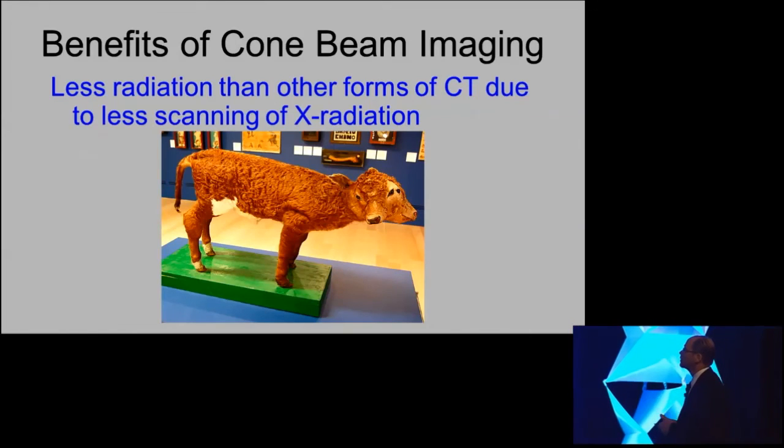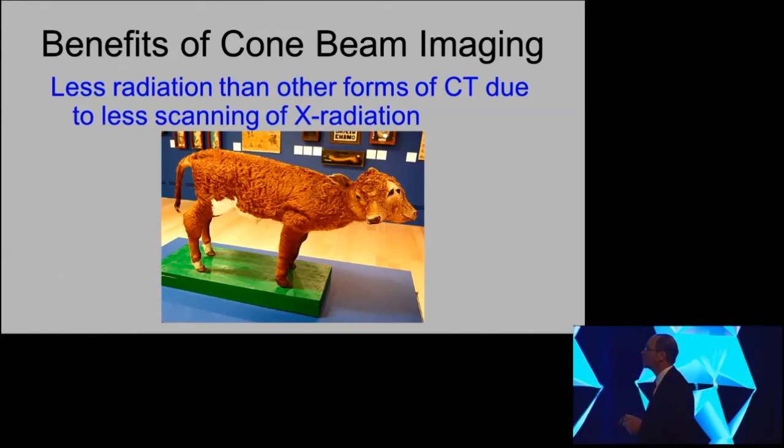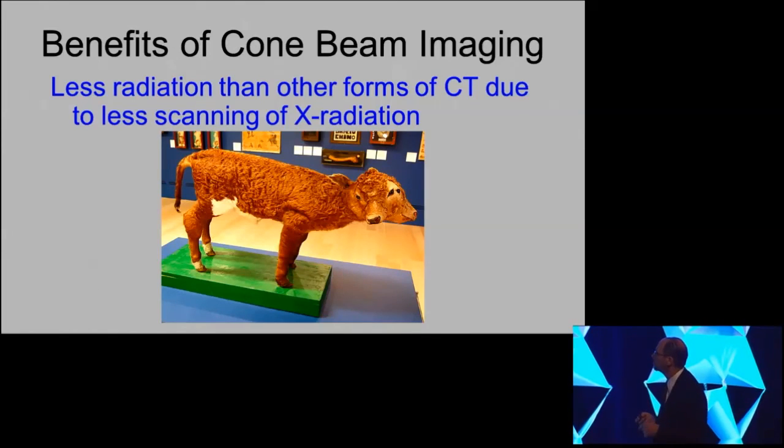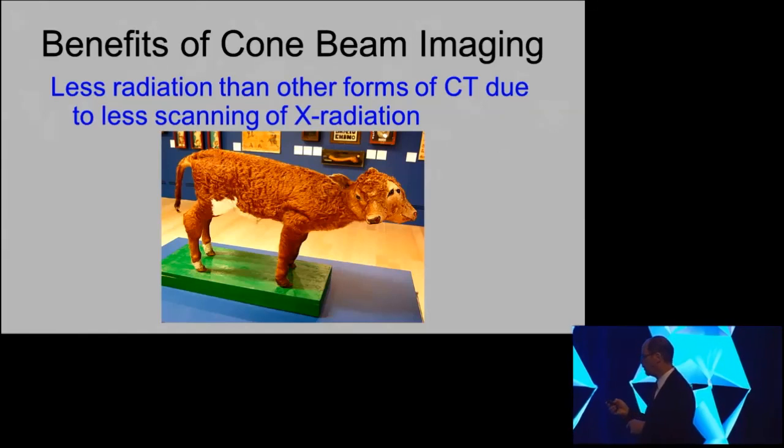All right, so one of the benefits, of course, is less radiation, and if we're just talking about hard tissue and the gray contrast in hard tissues, it is very good and with much less radiation.